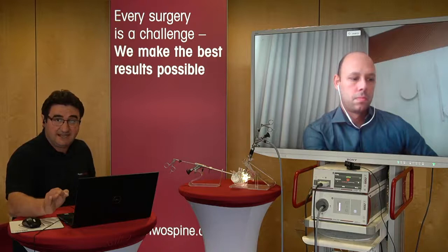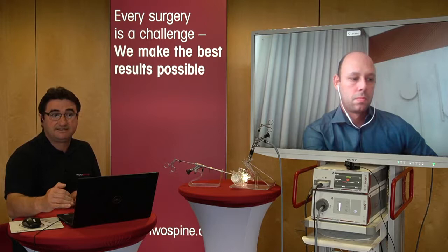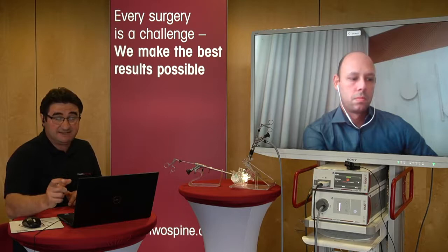Again, if you want to do only posterior decompression, for your side or the contralateral side, just for posterior decompression, you can use the stenosis system. Yeah, it is really faster and stronger. But additionally to posterior decompression, if you want to do anterior decompression like discectomy or osteophyte resection, then you cannot retract the root with the sleeve of the stenosis system, because the diameter of the sleeve is really 1 centimeter and it's really big. It's better not to do that.